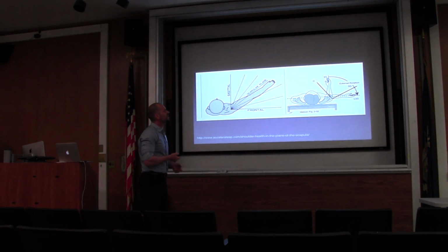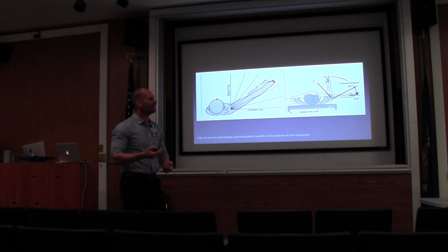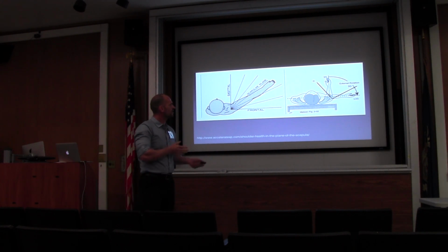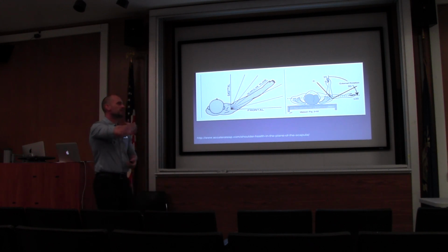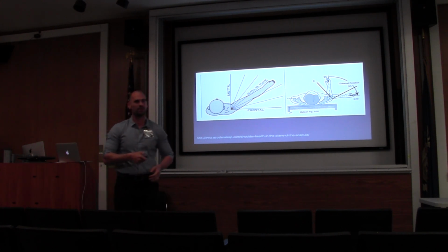There are just a couple caveats with anatomy that I think you need to understand, because I ran into pitfalls when I first started this procedure. First pitfall is the plane of the scapula. It's not at 0 degrees in the coronal plane. The plane of the scapula is actually off by about 30 degrees. So remember, when you make that injection, you need to come from an angle. Otherwise you're either going to nail the humerus or end up behind the glenohumeral joint.